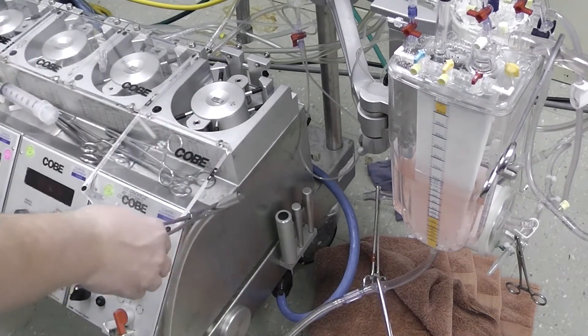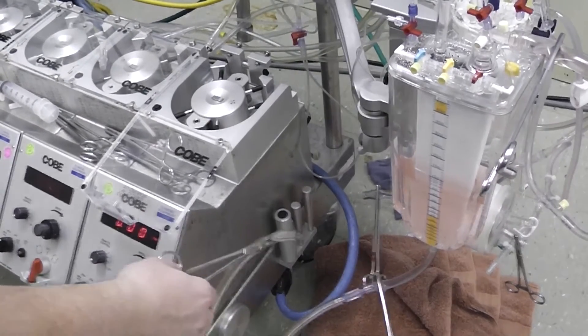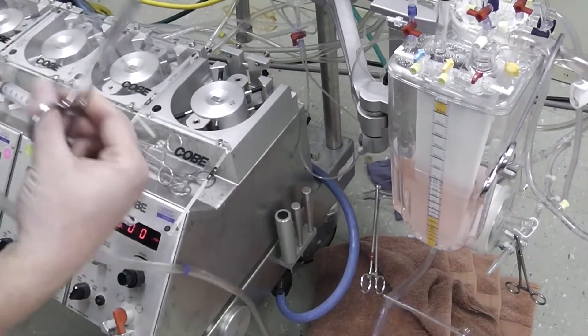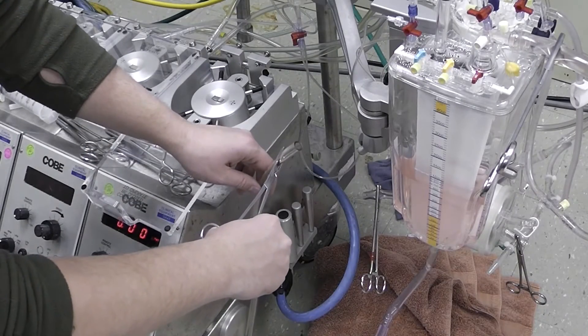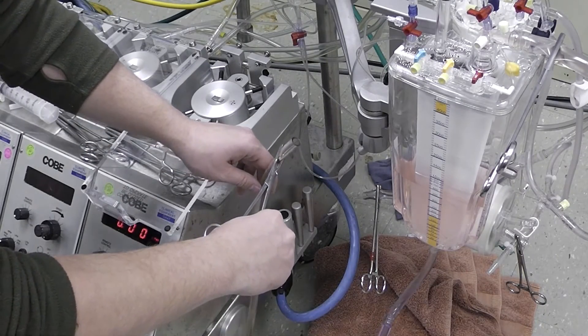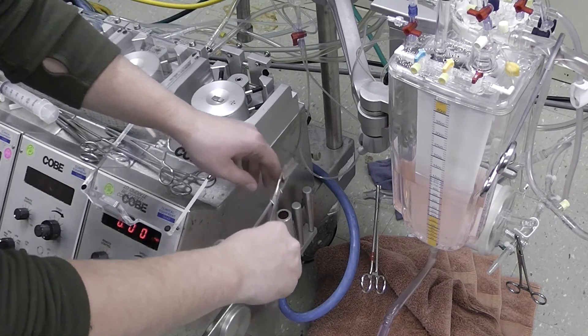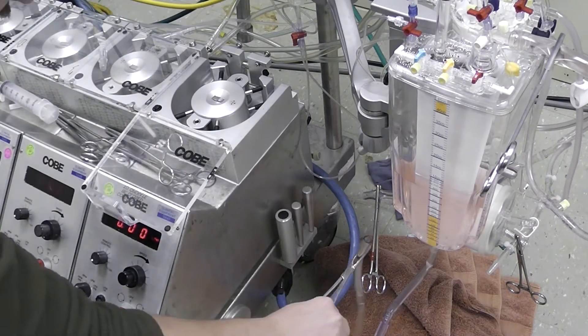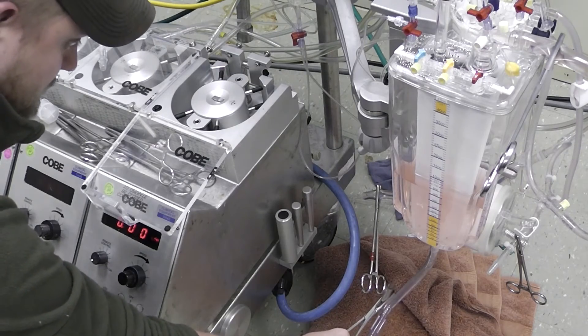Now we're going to start gravity filling this line so that this isn't all full of air. Open up that clamp and then start gravity filling this line until I get fluid almost all the way up to the top.